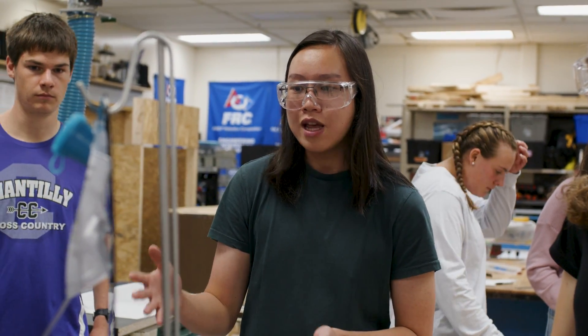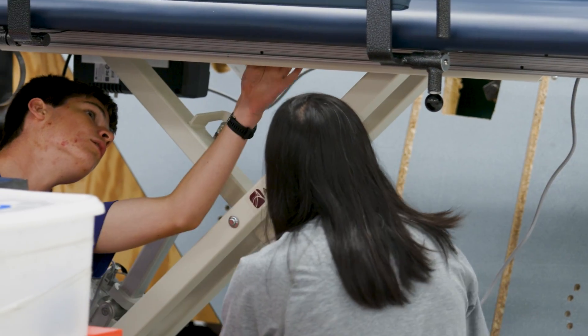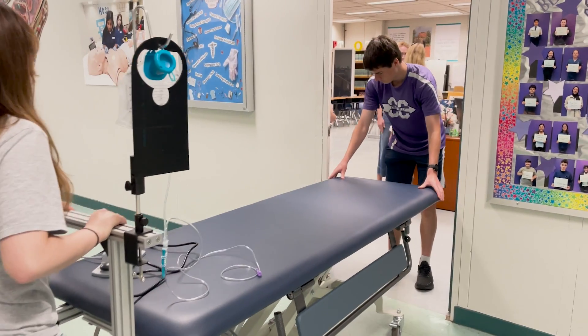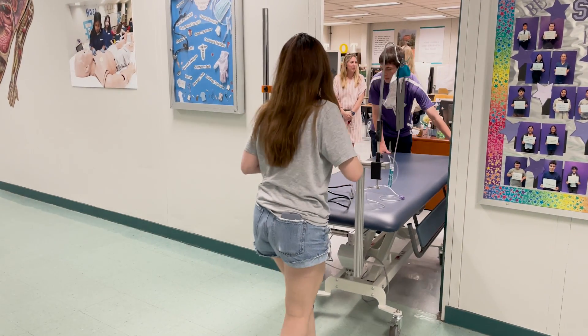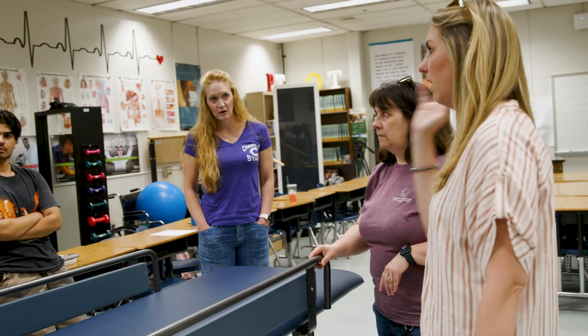We're going to actually test the bed itself and see how it performs. We will iterate on each of the components — for example, we might make something lighter, we might make something stronger, we might make something wider. Also, the vent has a loud buzzing sound, so you don't want that by your ear when you're trying to do school work.